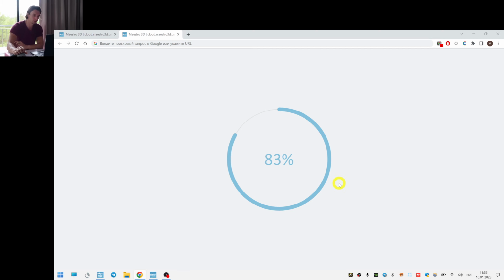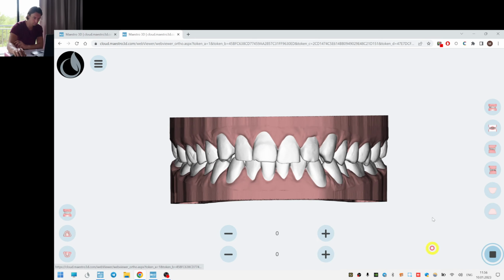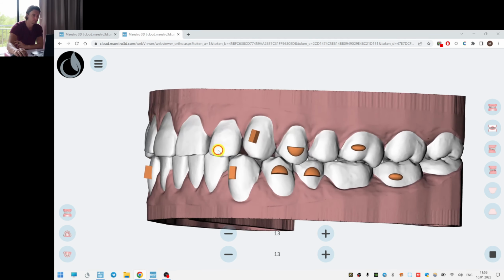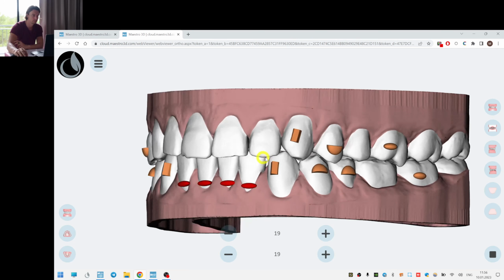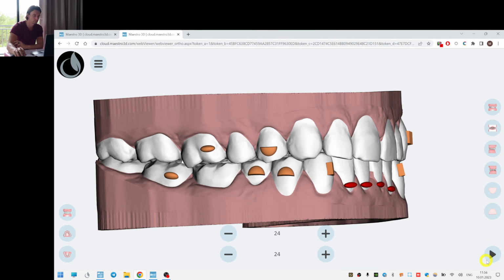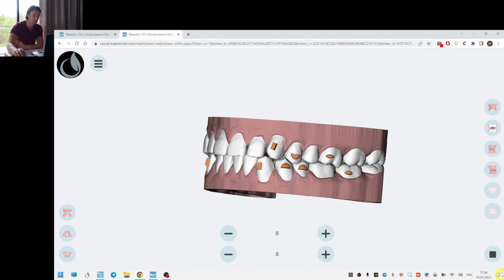Unfortunately, we cannot see the roots in this viewer, but maybe they'll update it in the nearest future. So we can start the animation and check all the movements. Check the final position if you like it or not.